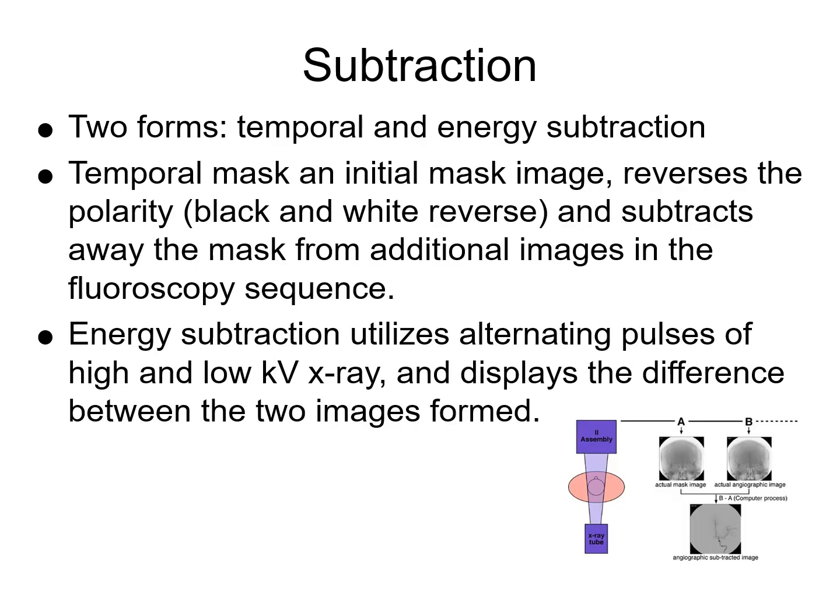All right, subtraction. Now the first time I gave this lecture, I thought I did pretty good with this. So temporal subtraction, that's time-based subtraction. This is the first way we figured out how to do it. This is the original version of subtraction, okay?